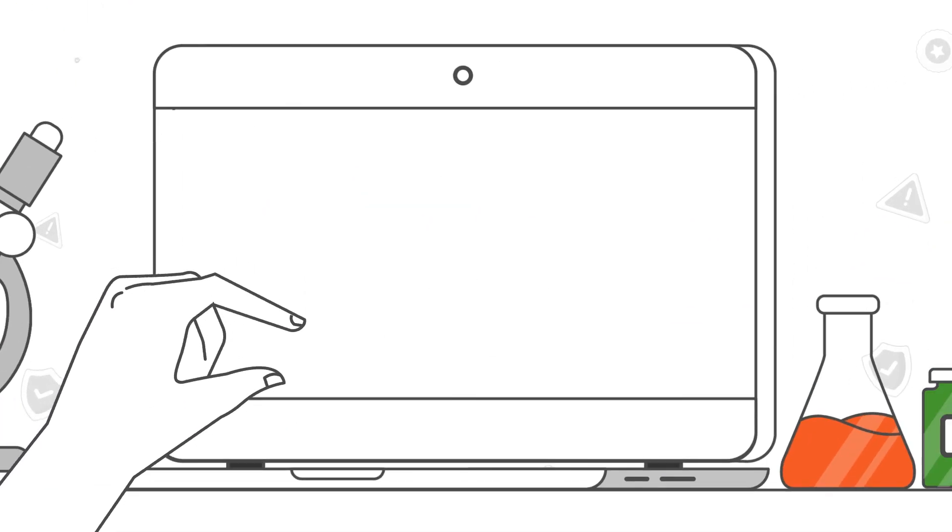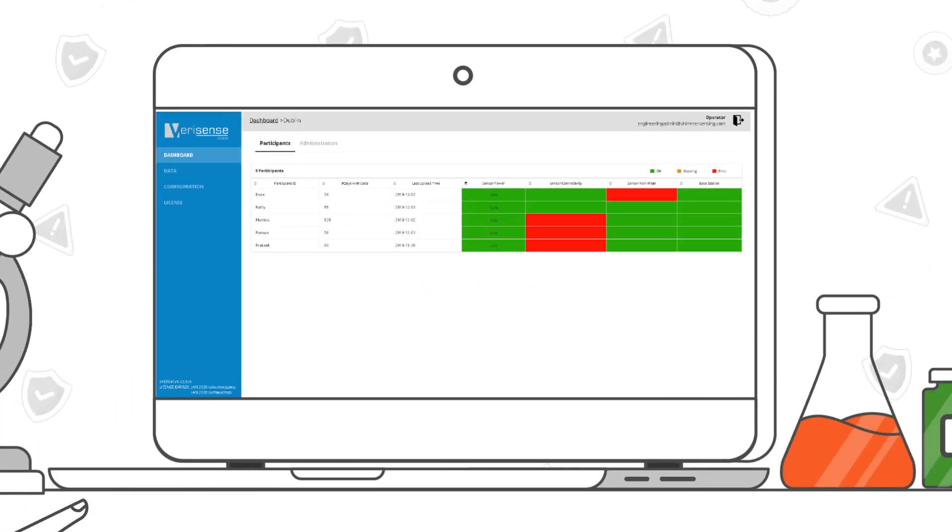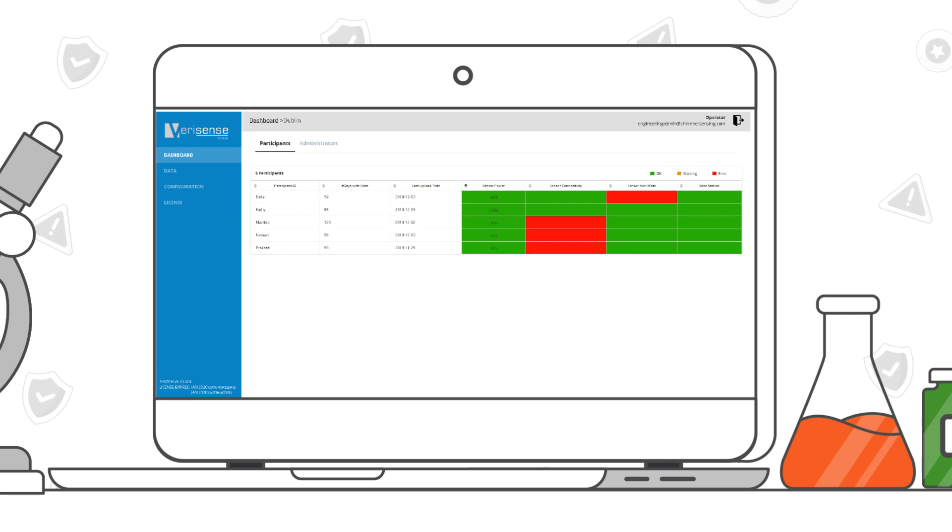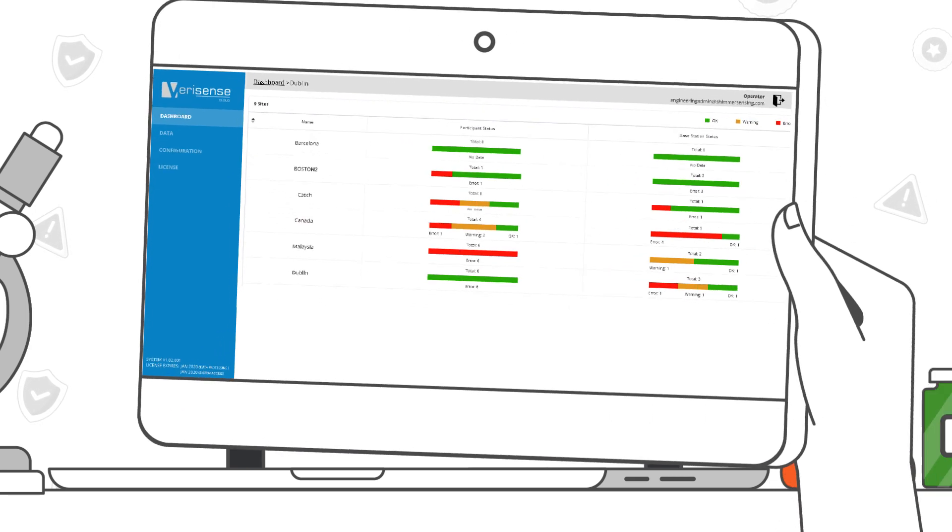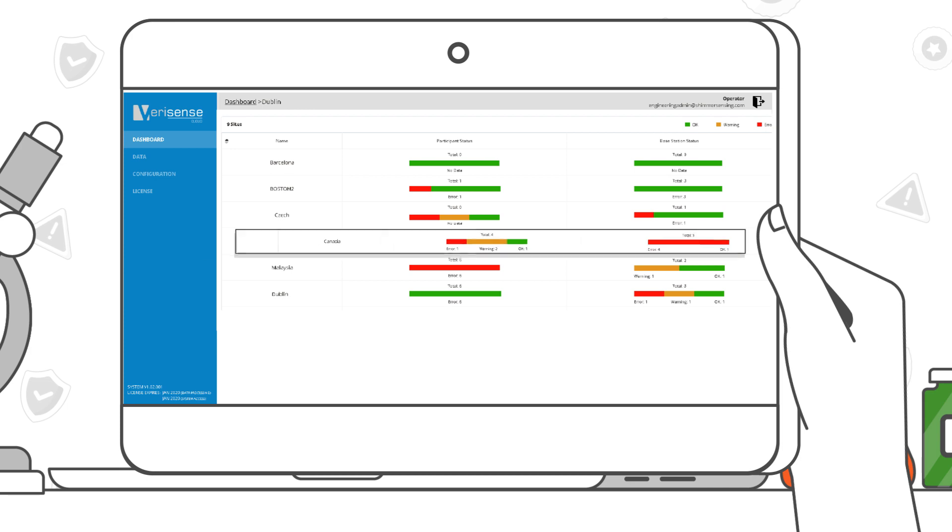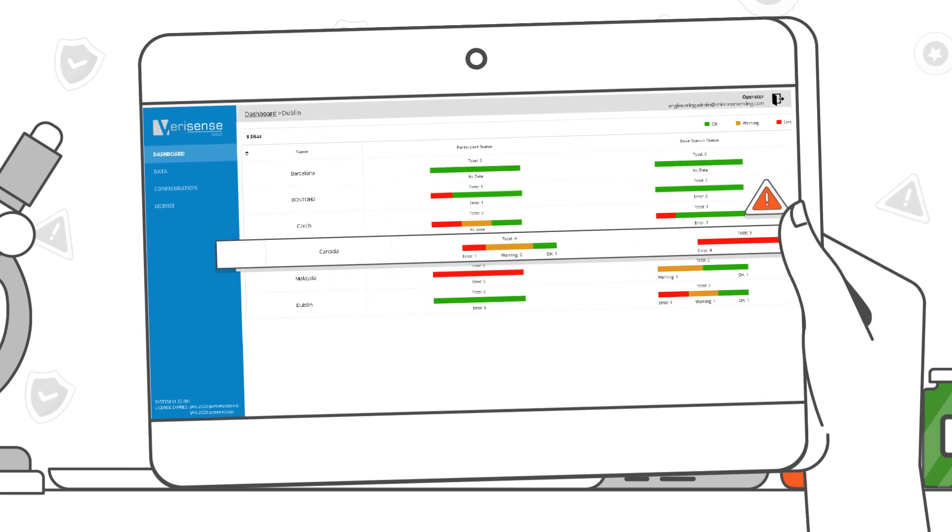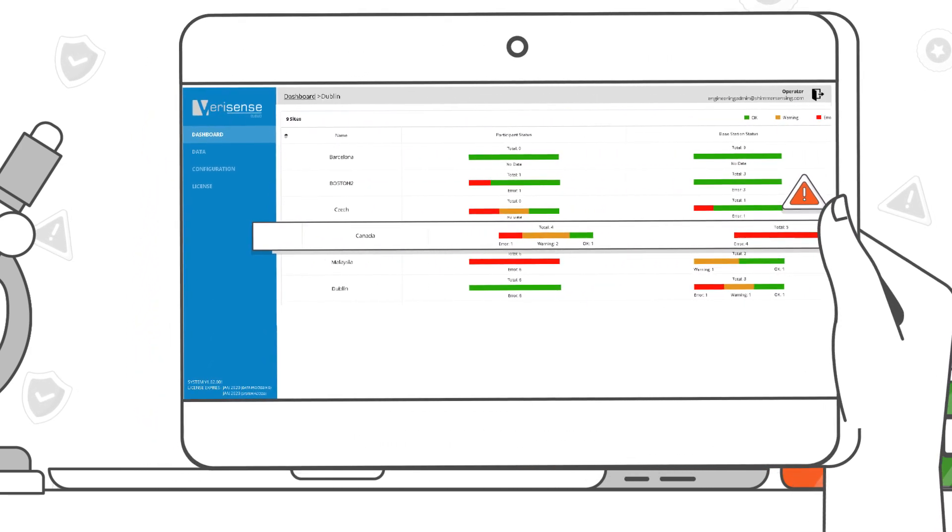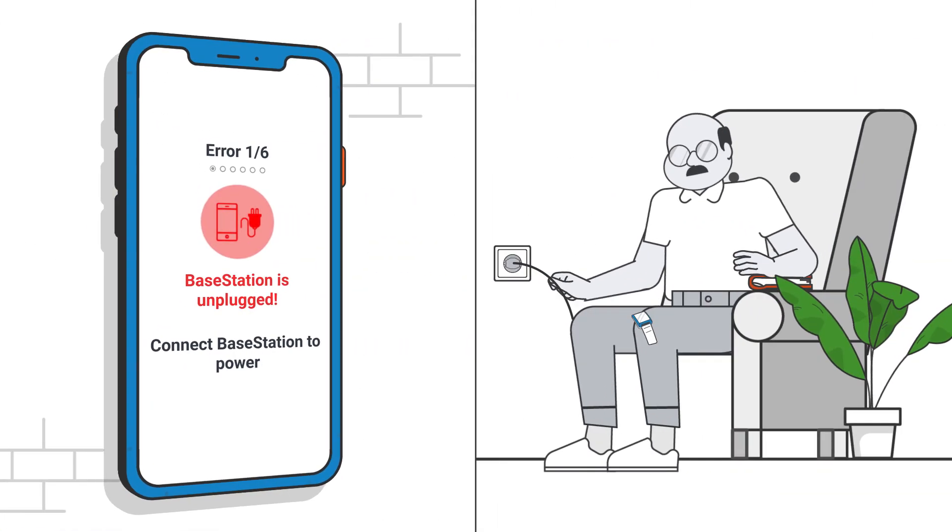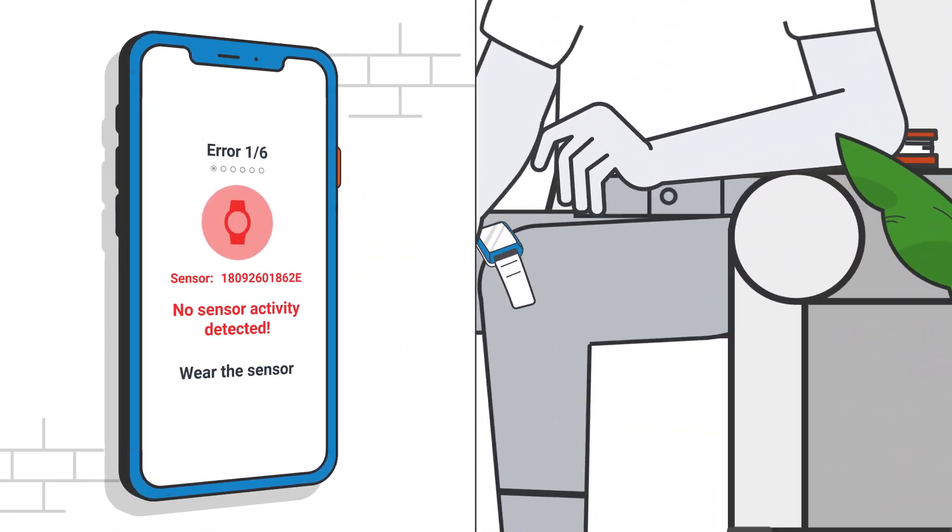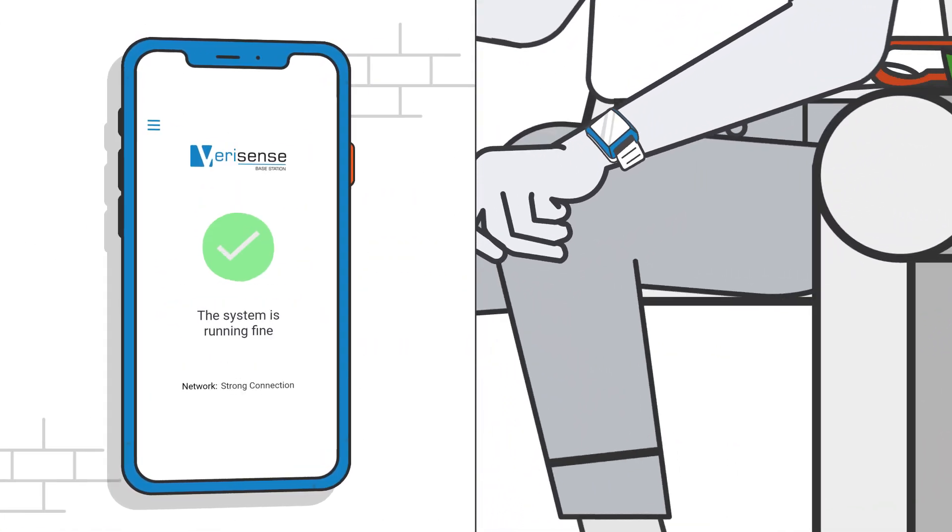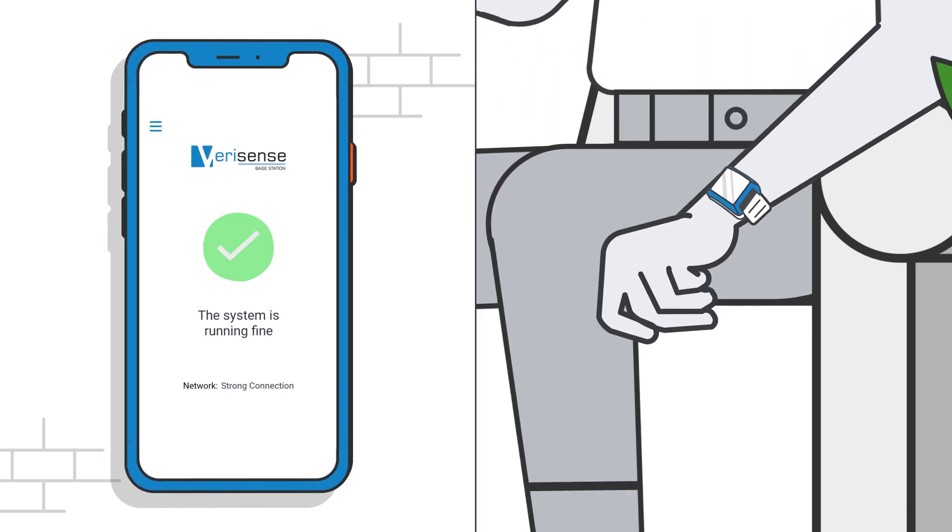For trial managers, the VeriSense cloud platform allows for seamless remote management of all participants' data. Multiple sites can be monitored at a glance. A sophisticated alert system will notify trial managers of any compliance issues such as non-wear detection or an unplugged base station and sends notifications, thus increasing compliance.